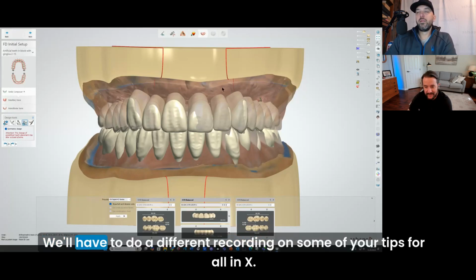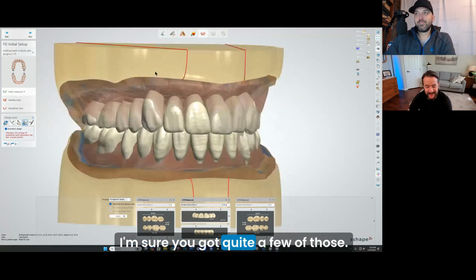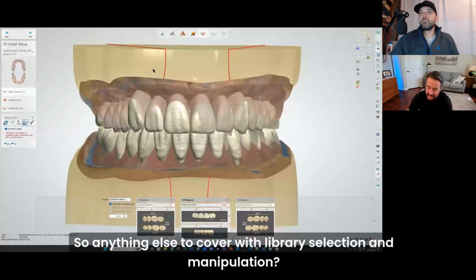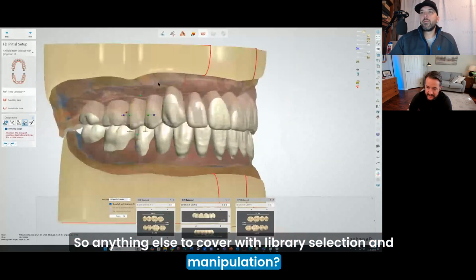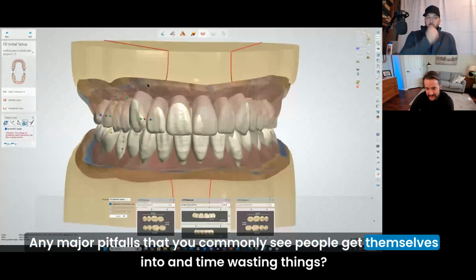Nice. We'll have to do a different recording on some of your tips for All-on-X. I'm sure you got quite a few of those. Yep. So anything else to cover with library selection and manipulation? Any major pitfalls that you commonly see people get themselves into and time wasting things?